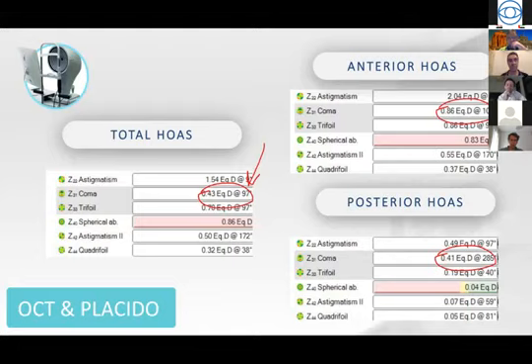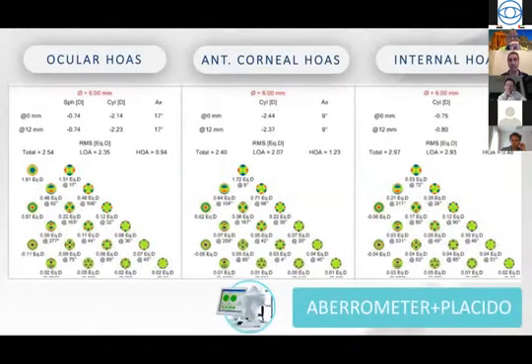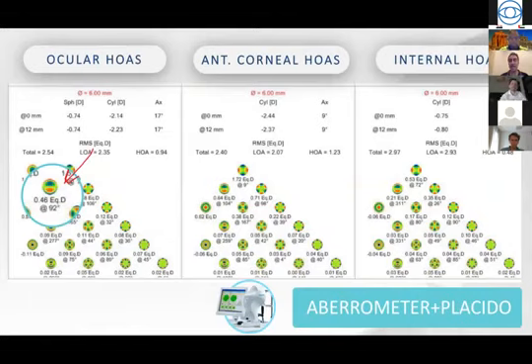Now we think, what if I have Scheimpflug? I don't think so, because the patient had haze, he's post-cross-linking, and guess what? Most of the patients coming to you are going to have irregular corneas, haze, and your Scheimpflug, from the lower definition and higher susceptibility to scatter, is not going to be able to provide that. I'm blessed to also have a pyramidal aberrometer from CSO, the Pyramis, also called the Osiris. So I always run it, and I always take a look at the holistic picture of the eye. And what I saw here is the ocular higher order coma. The total coma was 0.46 at 92, almost the same as my total corneal coma.